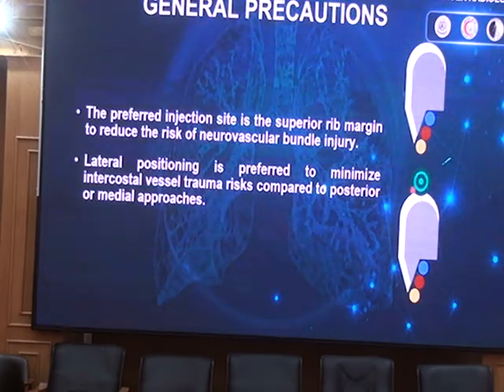Lateral positioning also is preferred over the posterior approach, because with old age vessels become more redundant and the possibility of injuring these vessels arises. So the lateral approach is preferred.